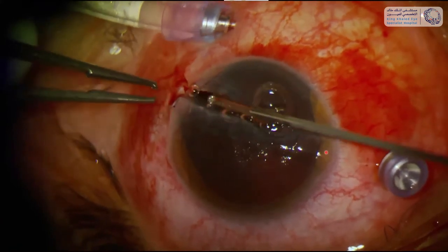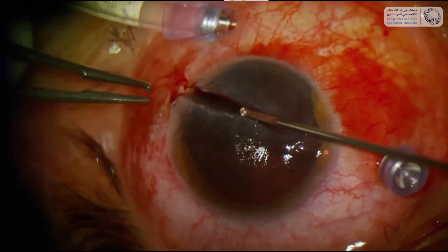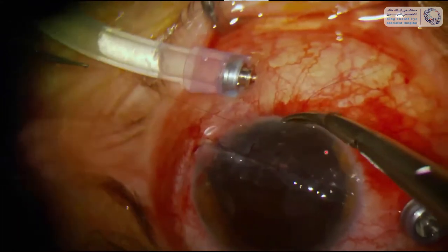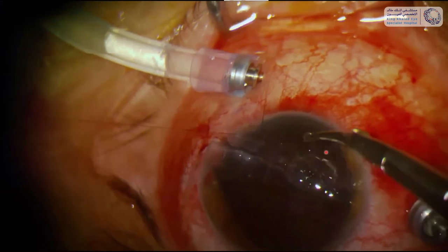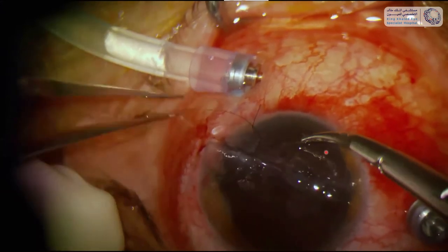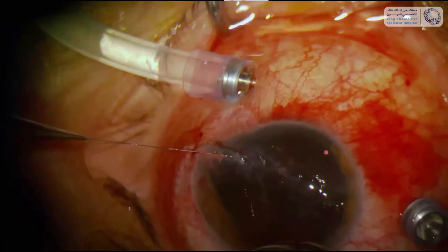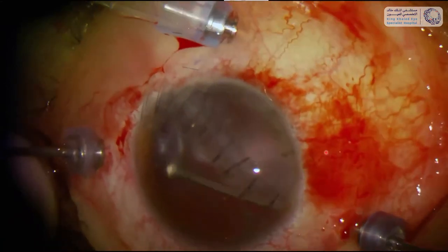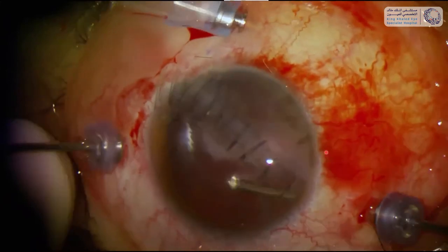I took the vitrectome and did some vitrectomy in the open wound to remove any prolapsing vitreous, and I started re-suturing again. 10-0 nylon is not my favorite suture, but anyway I managed to close it again, and so I could finally start with vitrectomy a long time later, and I found in the eye a quite large piece of glass.